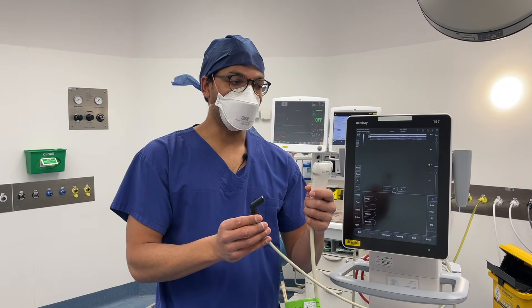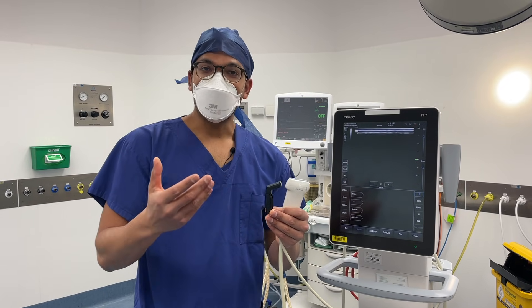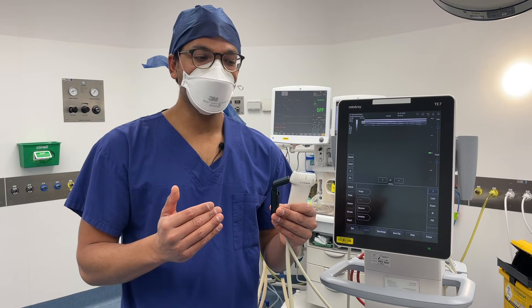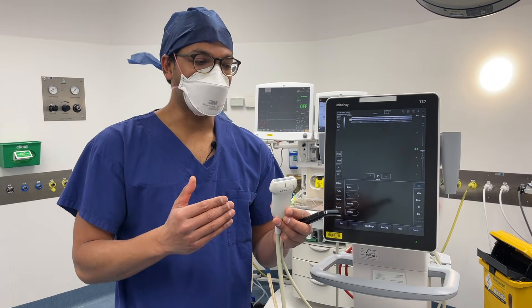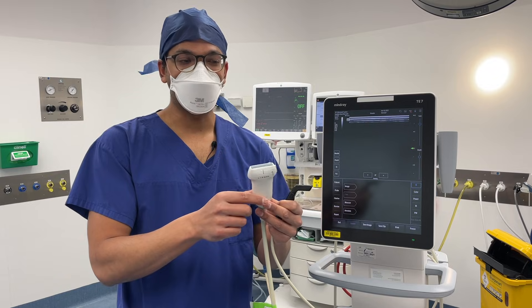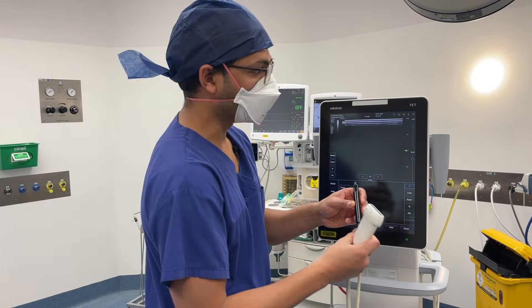There's a hockey stick probe and a linear probe. The hockey stick is high frequency, which means really good resolution but not as much depth penetration. The linear probe has slightly lower frequency, which still gives pretty good resolution but a bit more depth. Most of the time you can use either one — I pretty much go for the linear probe straight away, but they're both very useful.